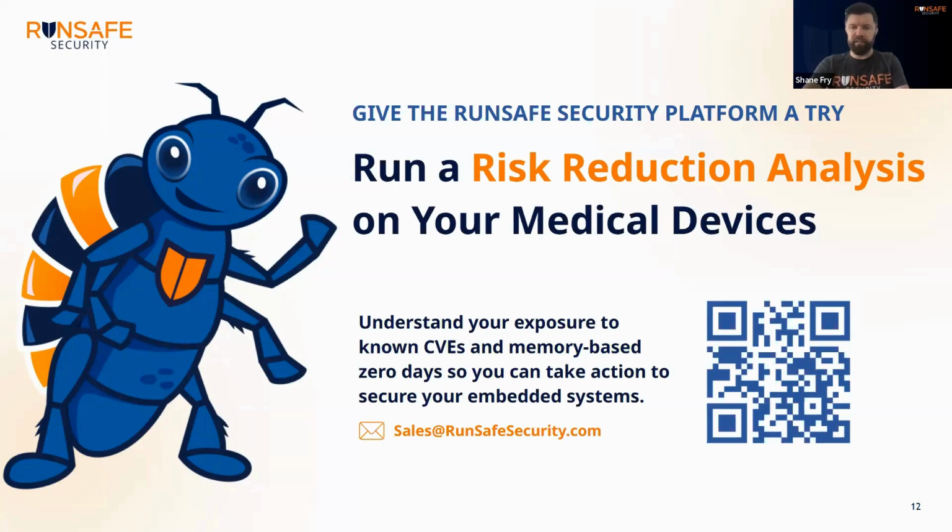In some cases, we've worked with manufacturers that had existing vulnerabilities that they knew in their devices, and we go back and actually integrate protections on an old version that has a known vulnerability. Then we can show that without their patch in place, the vulnerability was mitigated, and an exploitation wasn't successful. Now that requires a more advanced security organization, but we've done that with a handful of customers, and that works out really well. Then that can be a data point for the assessor to say, okay, we've talked about this from the academic side, we've proven it using an old vulnerability that we know about, and we've also got this risk quantification for future stuff, where we've looked at the whole picture and seen how much we can reduce out of it.